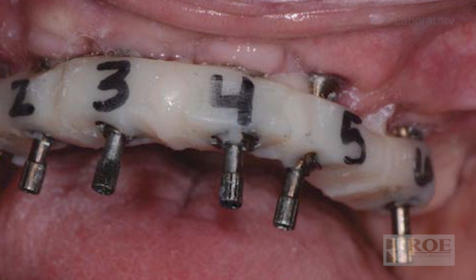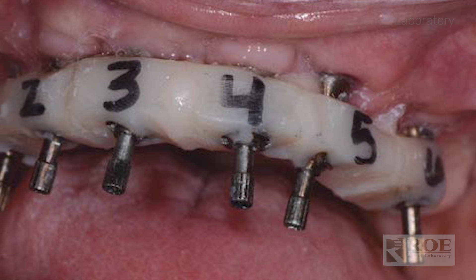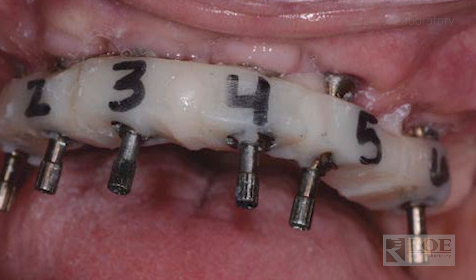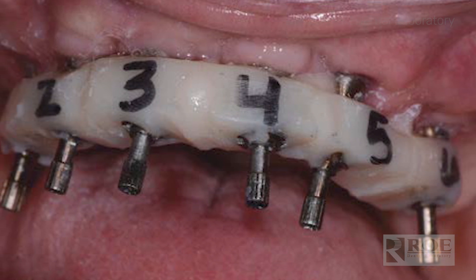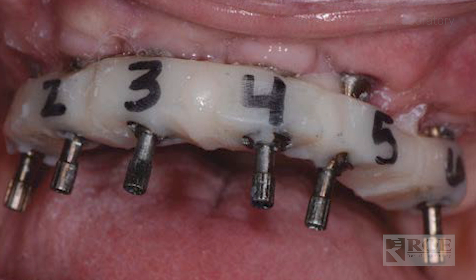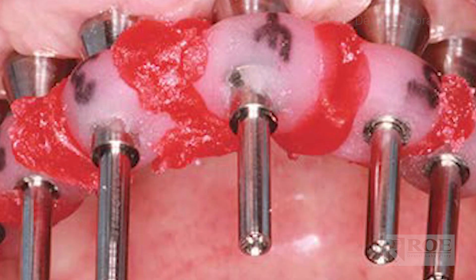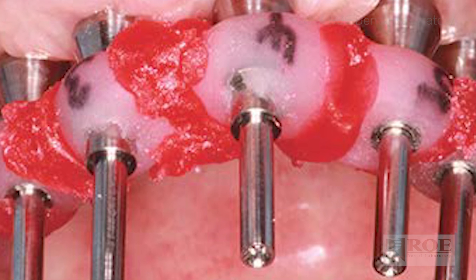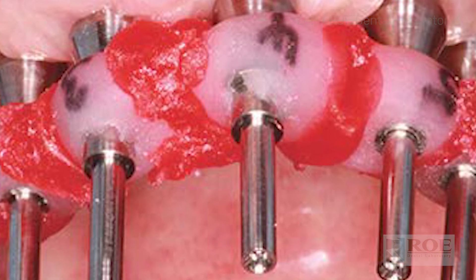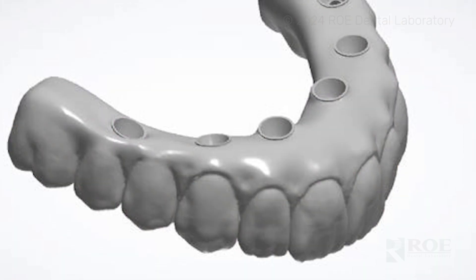The next step is your fit verification jig, and that's all in the same appointment. Remove the bite rim, seat the fit verification jig, and test for passivity using the one screw test. If you're not sure what the one screw test is or need a refresher, we have that available on our website. You'll see that verification jig — if you need to section it, section it — make sure everything seats passively, then reload it together and send those to the lab.